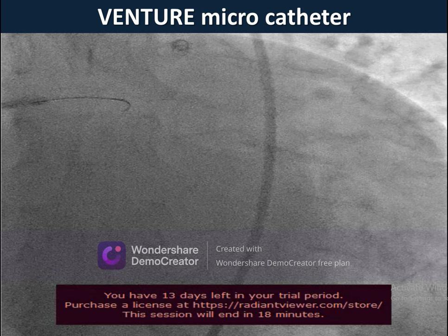Every wire hitting the proximal cap of the OM buckled in the LAD. This is because you have a tough CTO in a curvy LCX and OM, and also the LAD angulation with the left main is a right angle.